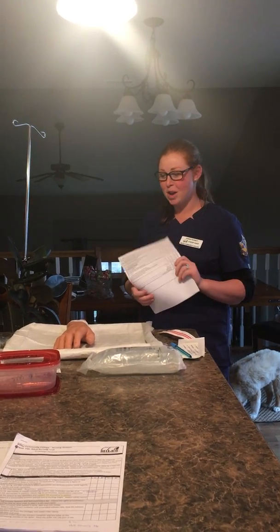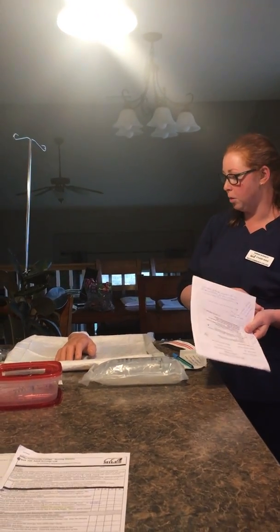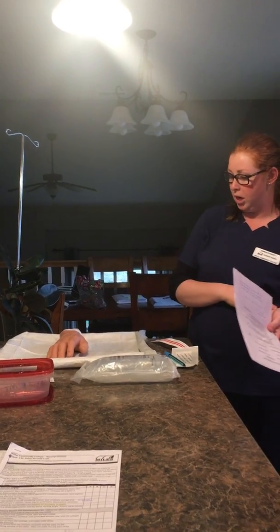All right, hey guys, we're here today. We're going to be establishing a peripheral IV on our patient here. Her name is Ivy Needed, and so we're gonna go ahead and get started.